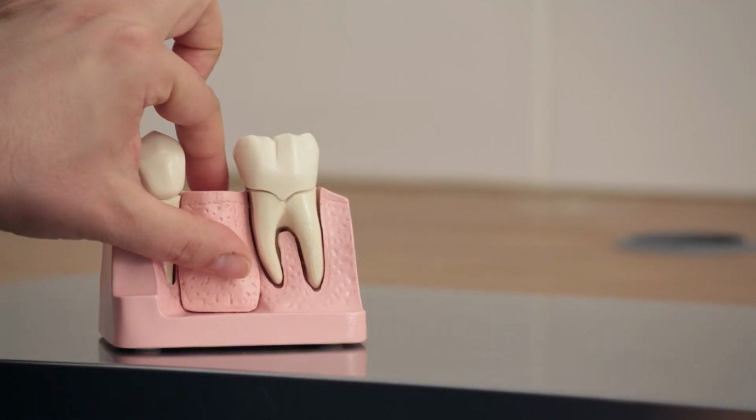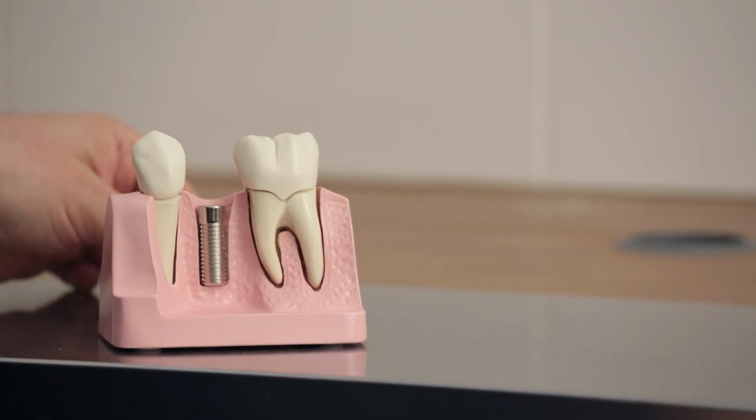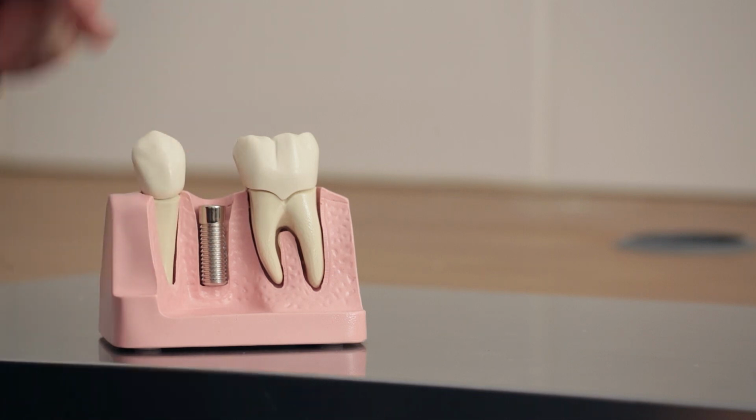Right, so the third option is a dental implant. Looking at this model over here, we've got the same scenario with the tooth missing in between two natural teeth. And unlike the bridge option, here we're placing an implant in between these natural teeth. The procedure is usually done under local anesthetic. It's no more complex, if anything even simpler to do than a bridge preparation.